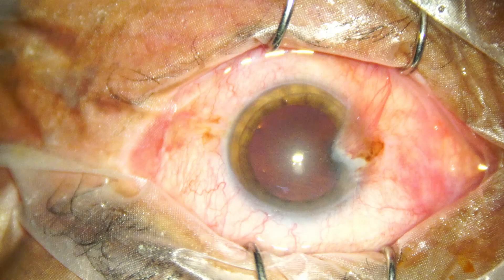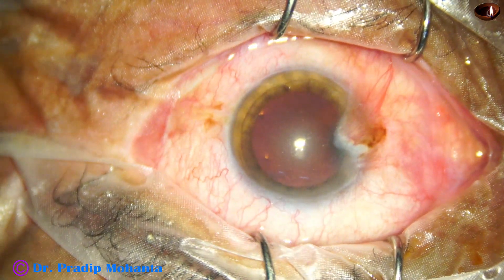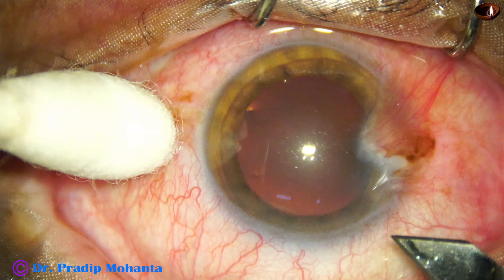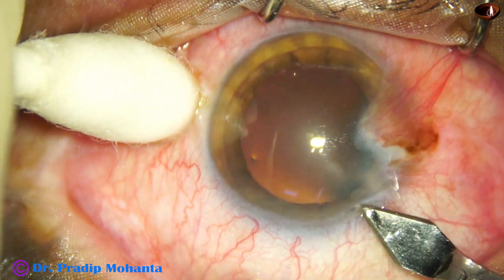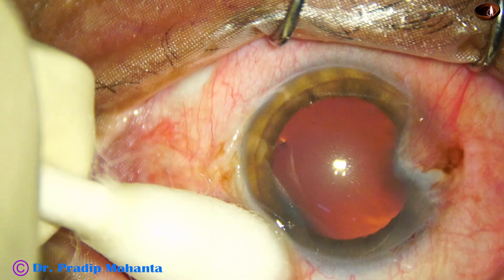Friends, welcome to my workplace for hands-on phaco and SICS training. This is a soft cataract with pterygium. In this case I have planned phacoemulsification with pterygium surgery — first phacoemulsification.